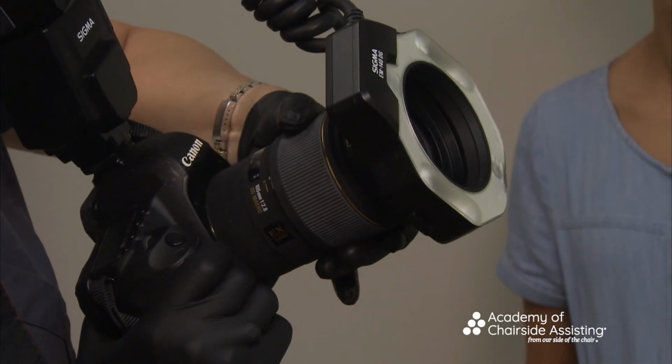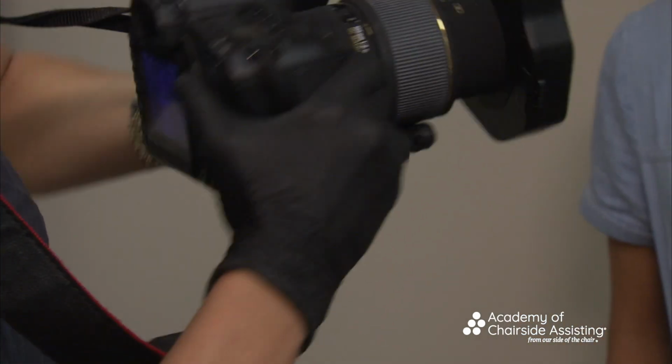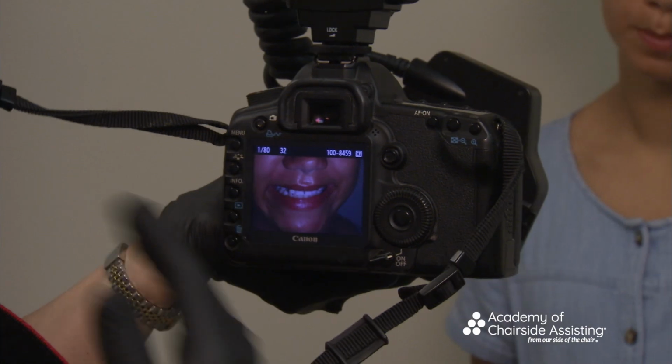Sometimes we might have to come out just a little bit because she is young, okay? But if you look here, you do see, and I train people to say, you don't want to see a whole bunch of the face, but she's tiny. I always try to remember that and really look at the photos we took the last time she might be in, and just know that when I take that photo, I'm like, oh, I see a lot of the face. So I might need to come out just a little bit.